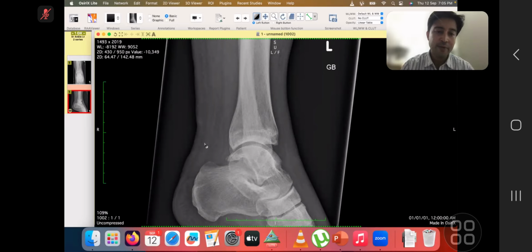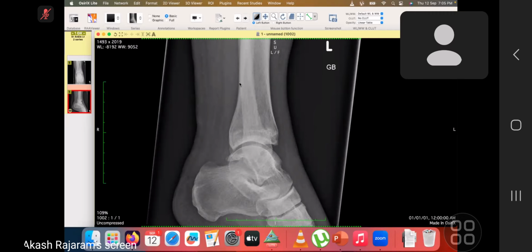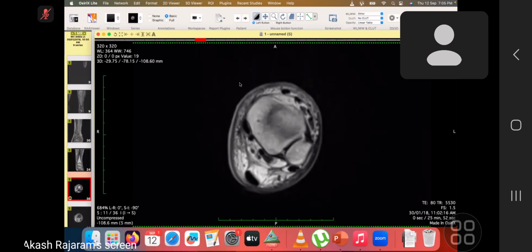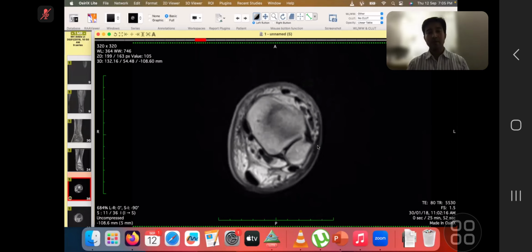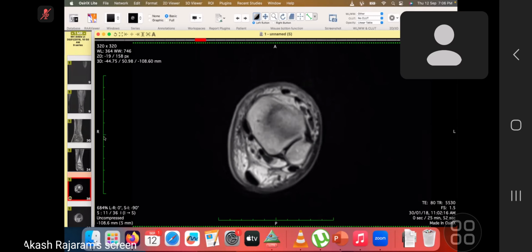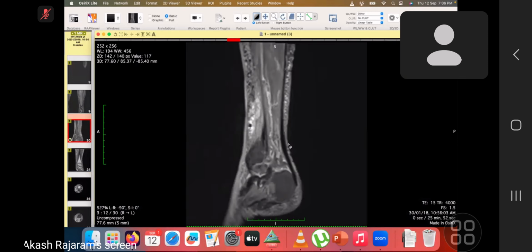Yeah, the sonographer is not available right now, so they just went ahead and did an MRI. Okay. I'll just request control. Any particular sequence you would like to start with? Okay, you can start with this one.